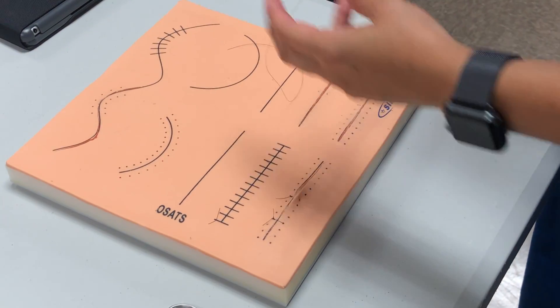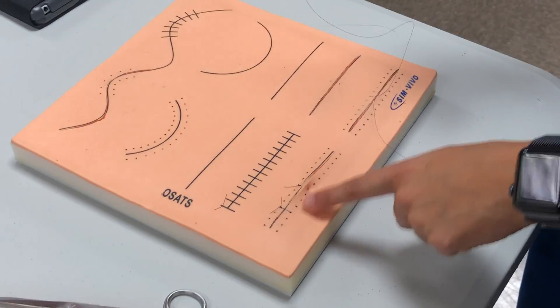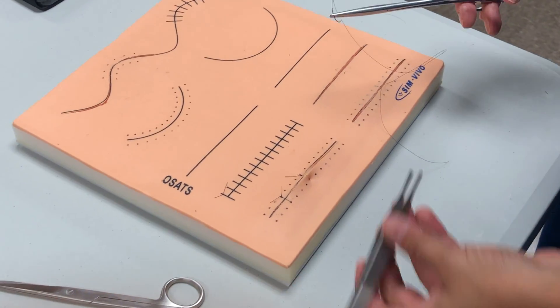Alright, so now we're going to do a continuous or running stitch. We have our simple interrupted, our vertical mattress, and now we're going to do a continuous stitch.